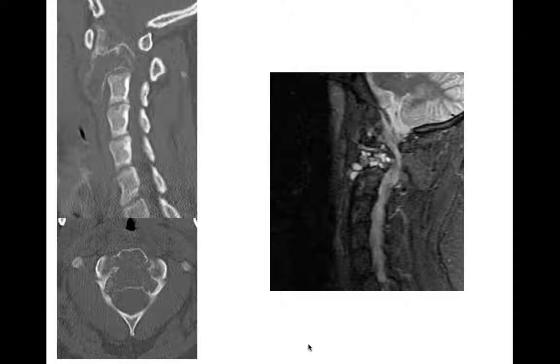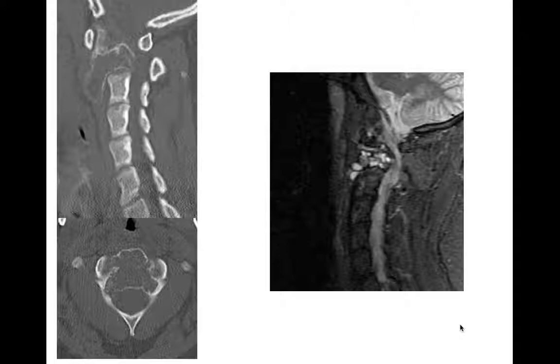Moving on to expansile lytic lesions of the spine and vertebral bodies — not ivory in this case. Here we see an expansile lytic lesion involving the dens, shown on axial imaging with a narrow zone of transition, no periosteal reaction, and thinned cortex. On MR, there are fluid-fluid levels. This was an aneurysmal bone cyst. It's not uncommon for ABCs to occur within the spine, vertebral body, or posterior elements — a good location, especially in a younger patient.